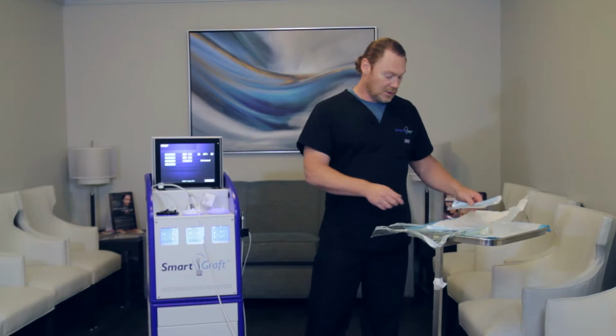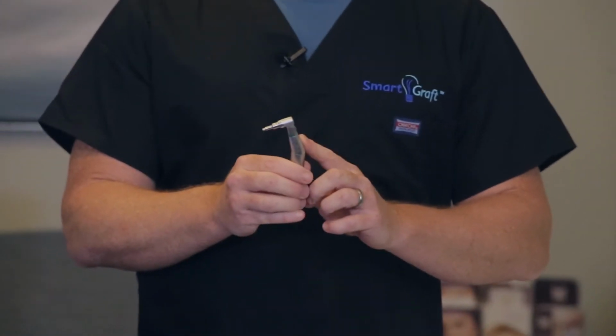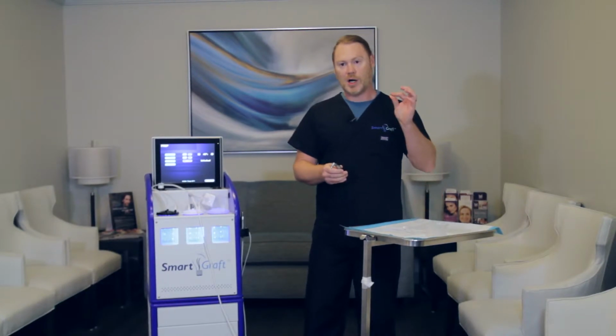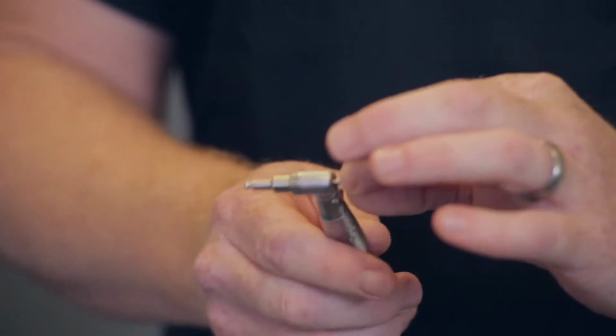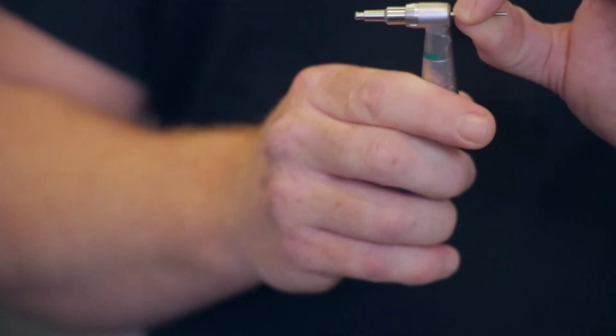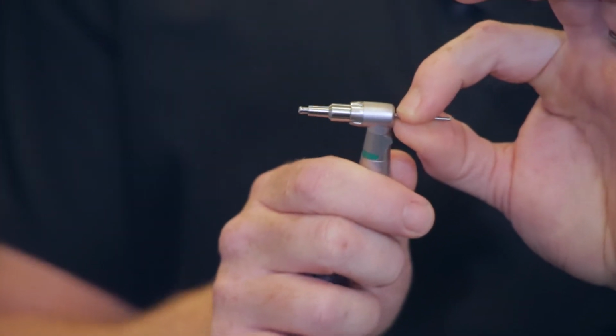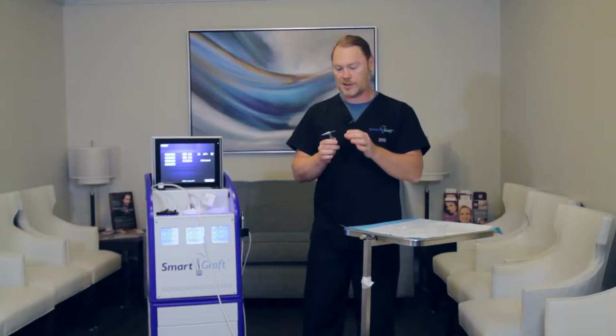Now we have to do the handpiece itself. So this is the handpiece that connects to the motor. First, I like to put in the punch. It does have a little locking mechanism, so the easiest way to do this is just to set in the non-cutting edge and just do a light little tiny twist, and it locks right in. Cannot come out. That's how you test it to make sure that it's in there securely.